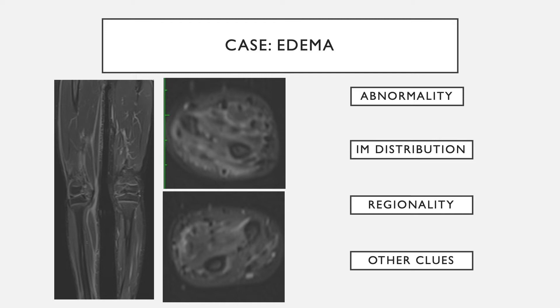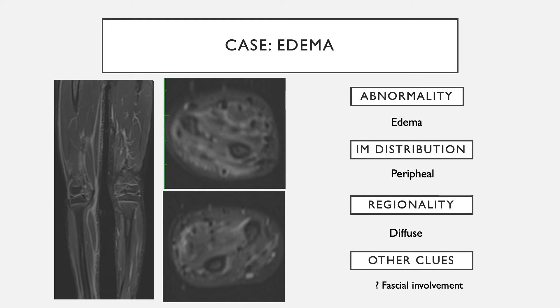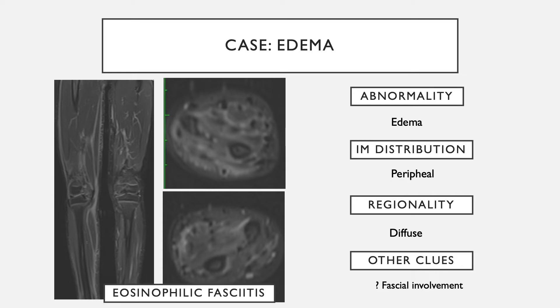In another case, there is increased signal within the muscle on fluid-sensitive fat suppressed images — the abnormality is edema. Looking more carefully at the intramuscular distribution, the increased signal is primarily along the peripheral margins of the muscle — a peripheral distribution of edema. It involves almost all muscles. Given that this is perifascial, one should ask whether the edema is within the muscle or actually in the fascia. Putting this together, this is more like a myofascial syndrome such as eosinophilic fasciitis.